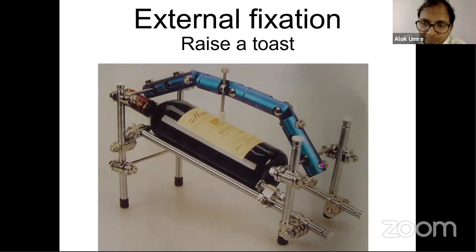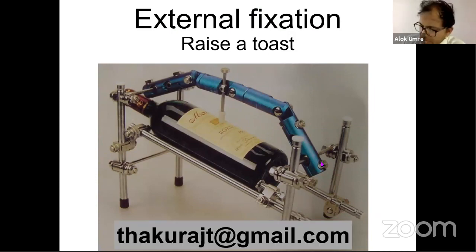Sir, Professor Punkar from Amravati is asking, in compound fractures, short oblique fractures, can we do interfragmentary fixation and then apply the external fixator in neutralization mode?